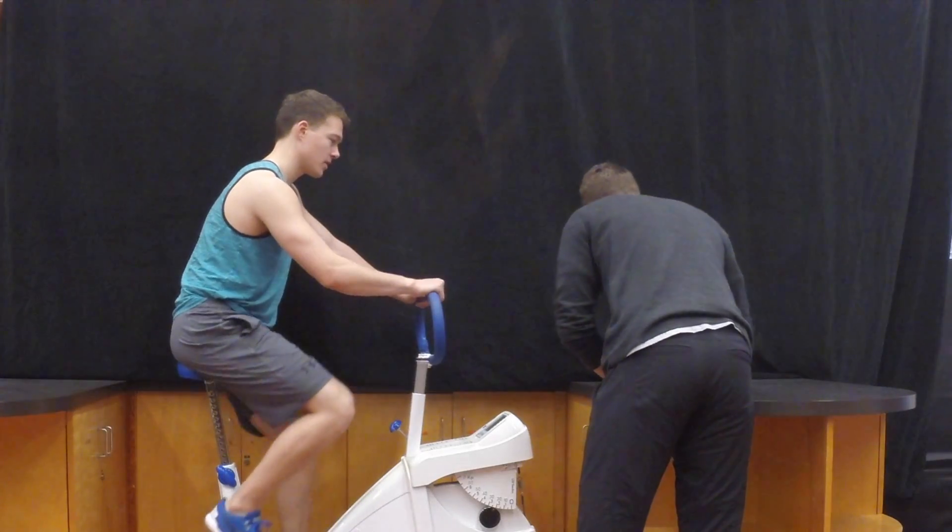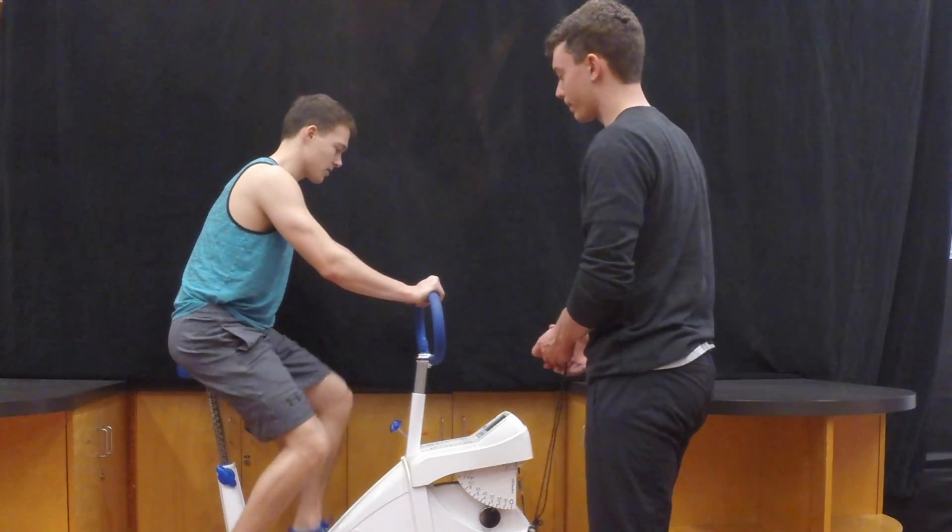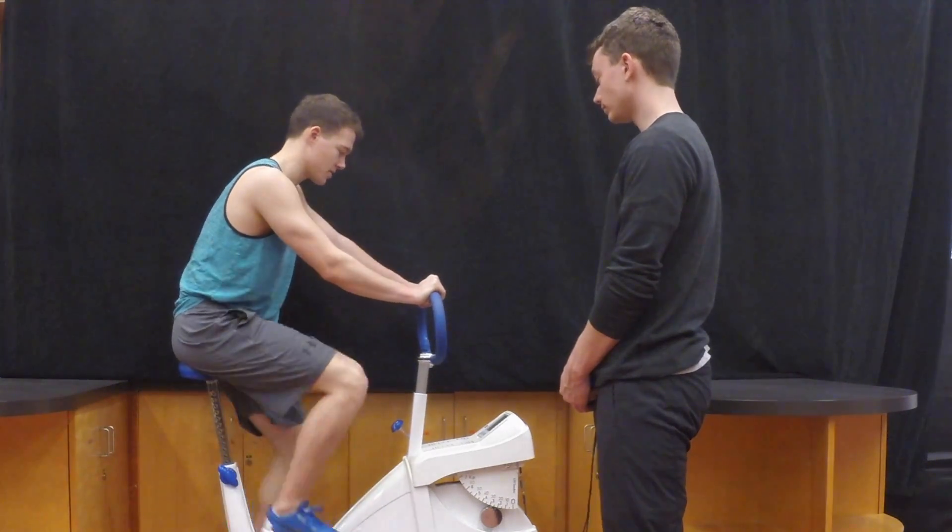Regardless of whether or not you had to adjust the resistance, record their heart rate, RPM, and workload at the end of each minute — that means minute 3, 4, 5, and 6.